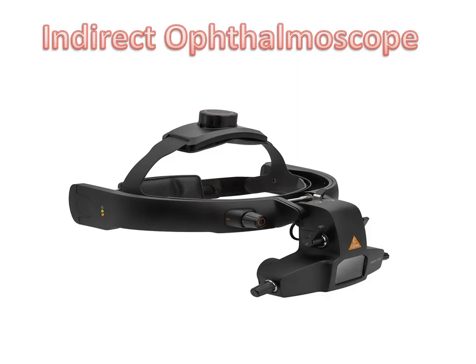After knowing everything about direct ophthalmoscope, we will now come to indirect ophthalmoscope. Indirect ophthalmoscope equipment is slightly complicated when compared to direct ophthalmoscope. It has got a headband, it has got condensing lenses. So just like in any other ophthalmic equipment, it has got a mechanical part, it has got an illumination part, and it has got an optical part.